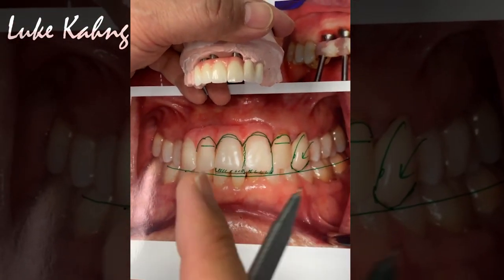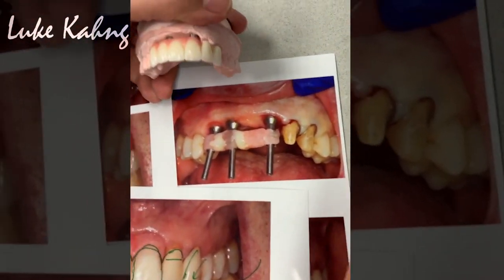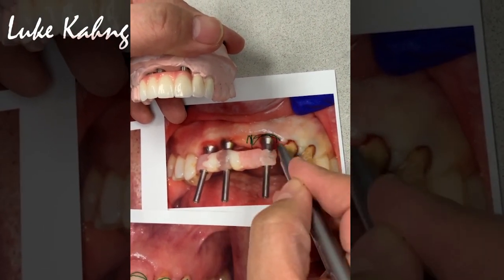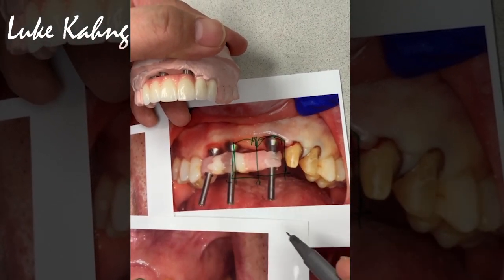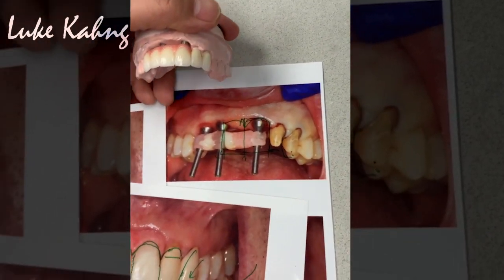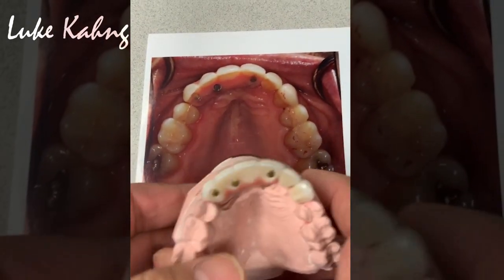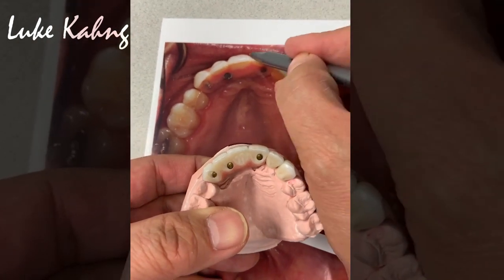The restoration. It's a pretty tough case, which is a 3 implant, the starting point. It's a nice placed implant, and then we just measure it between the tooth shape and contour from here. Okay, it's the lateral. Okay, now it's a nice prep. Great. So now, here is the patient's occlusion view, which is this.